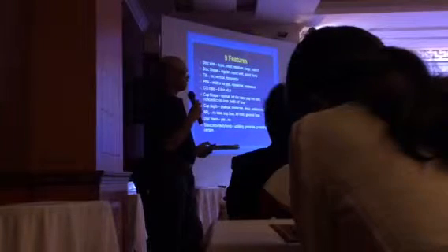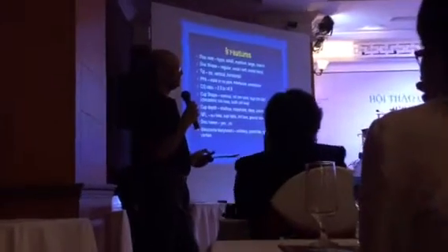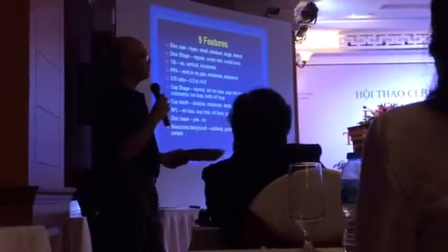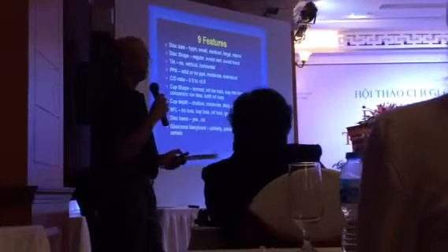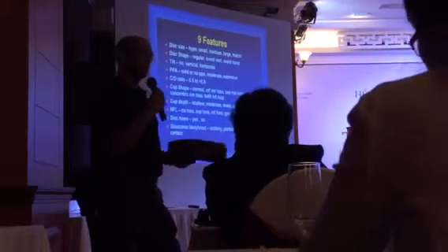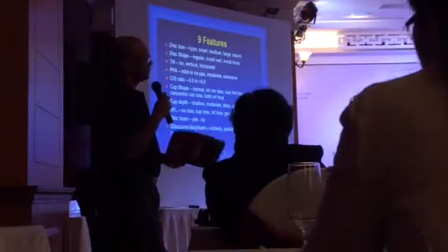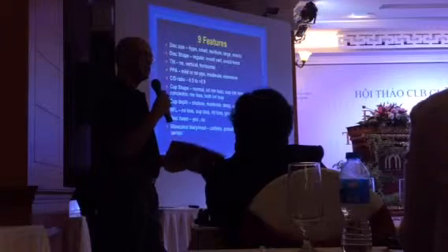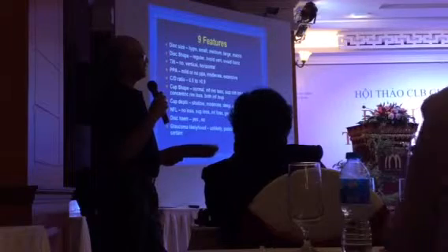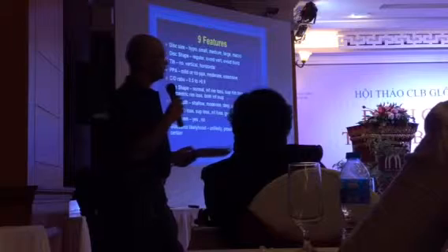So we look at the disc size, the disc shape, whether they're regular, horizontally or vertically ovoid, tilting, peripapillary atrophy, cup disc ratios. They've only got cup disc ratio options of 0.5 to 0.9, so they don't have small discs, because it's primarily aimed at looking at people who have glaucoma as cupping. The cup shape, cup depth, nerve fibre layer loss.